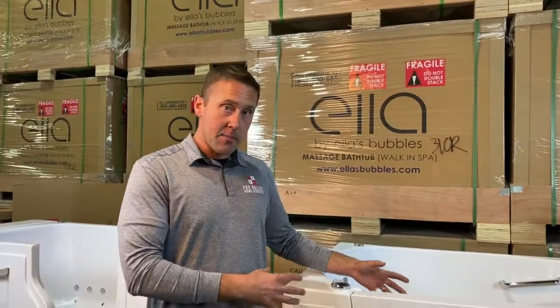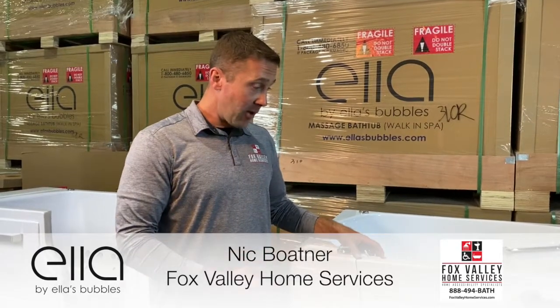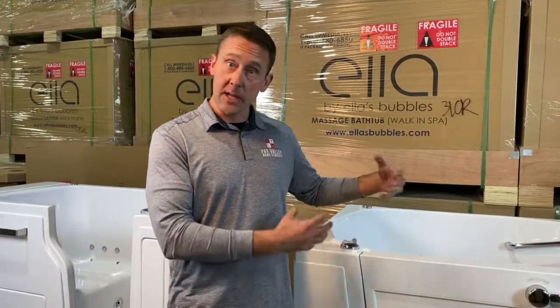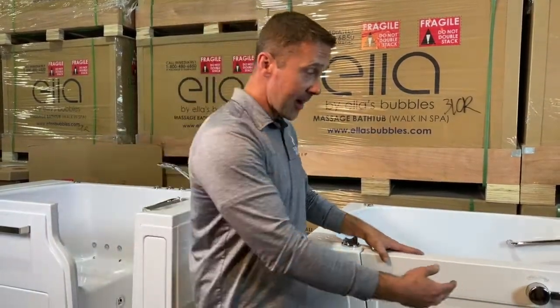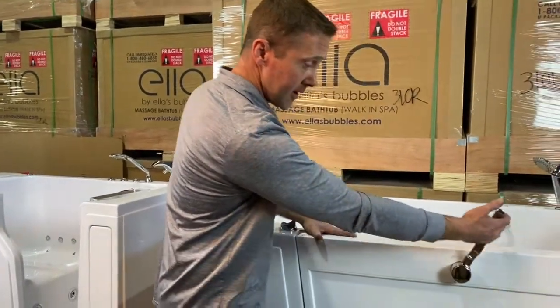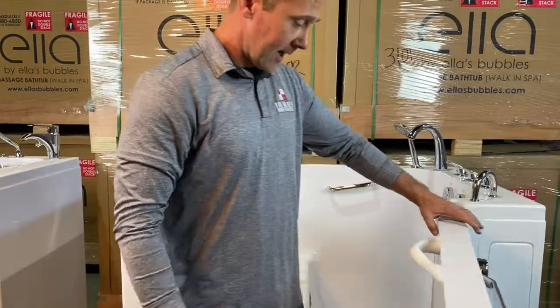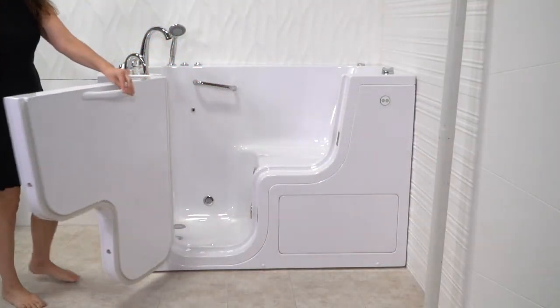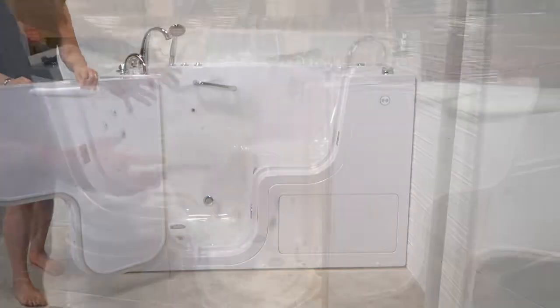The next lineup of walk-in bathtubs we want to talk about are our transfer models. These bathtubs are ideal for any bather looking for completely unobstructed access. The outward swing door works with a nice silky smooth two-pin system to lock the door seal, just like a vault door. The door swings open a complete 180 degrees. These come in five different sizes and models, completely customizable.